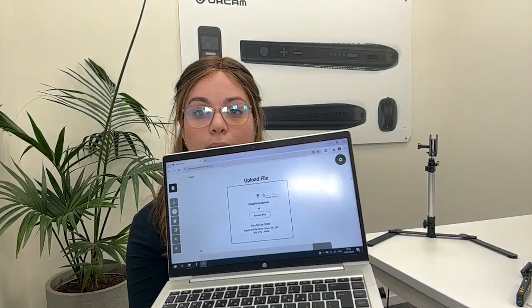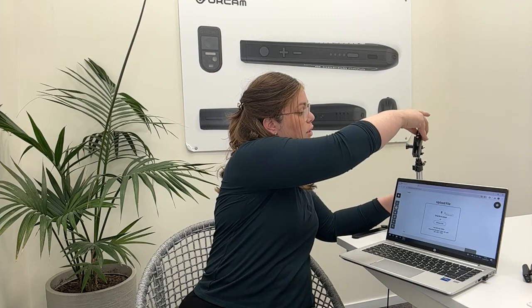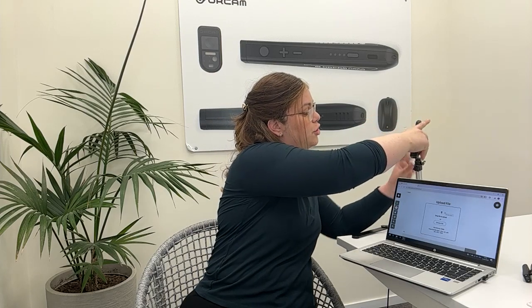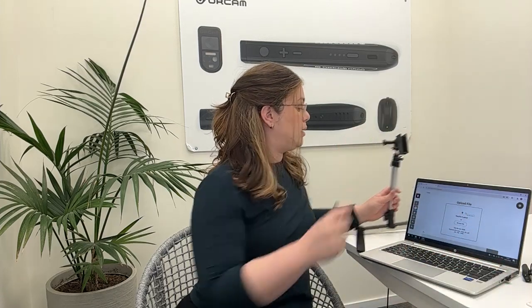Okay, so here is the interface of the magnifier. I don't know if you guys can see it, but this is what it's gonna look like when you log in. To get into your Smart Magnifier, if you have the OrCam Read 3 or the OrCam MyEye 3, you have a USB cable that comes with it, and you attach it to your computer. That way you can take pictures of books. You also have the stand to put it in. You can slide your device into the stand, place a book underneath, and take the picture. So it's super comfortable, really hands-free, and you can manage what you'd like on your computer. And any computer screen that you have, you can use this with, okay?